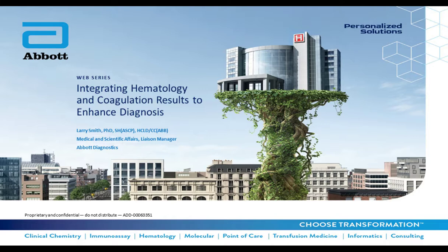So if you have an analyzer that can actually identify these schistocytes, this would be done within a minute of running the sample. This really could help improve the turnaround time when it comes to treating these patients. Otherwise, if you have to depend on a peripheral blood smear, you certainly have to wait until the slide is made and wait until it's stained, and then for someone to look at it. So having an analyzer that's capable of identifying these fragmented RBCs could certainly be very advantageous.